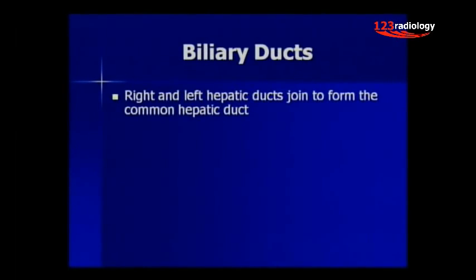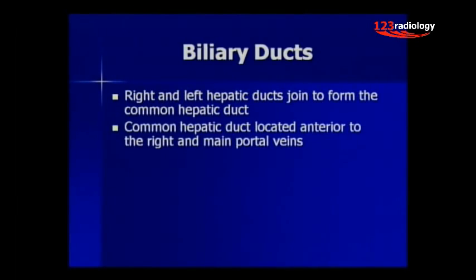And again, we're going to start with anatomy, looking at the right and left hepatic ducts, which join to form the common hepatic duct. And the common hepatic duct is going to be located anterior to the right and main portal veins.